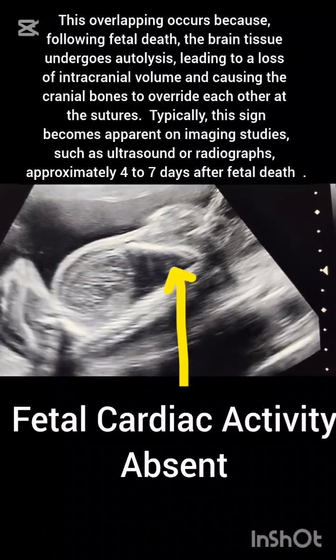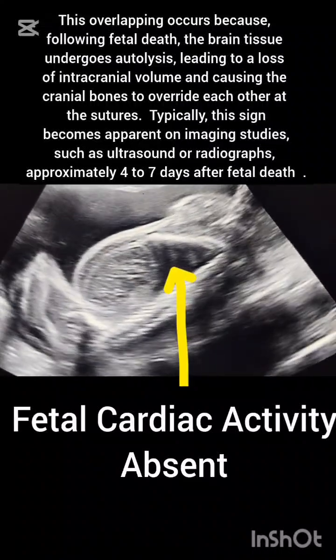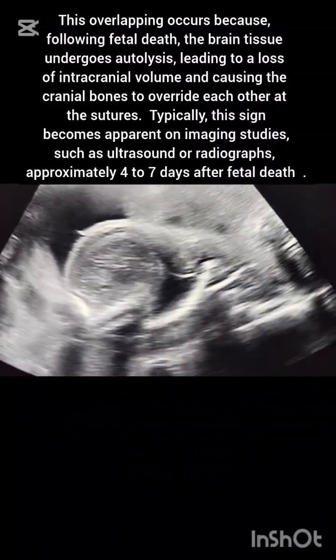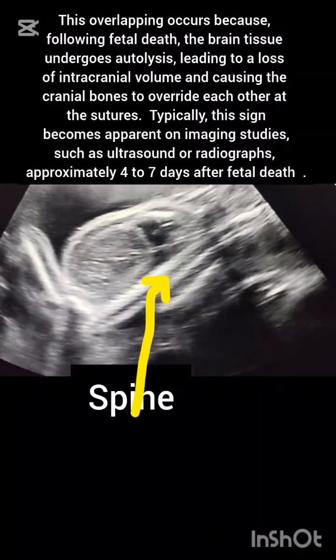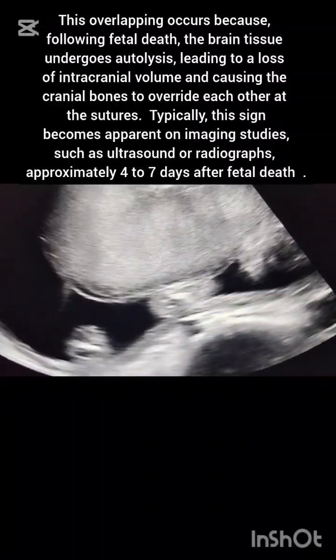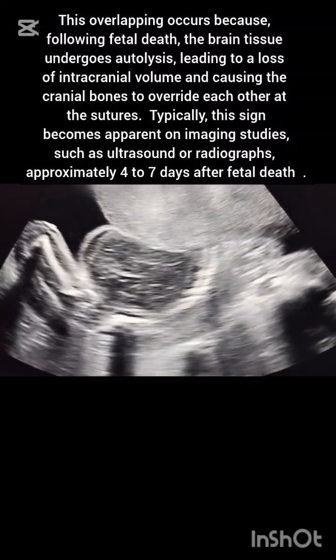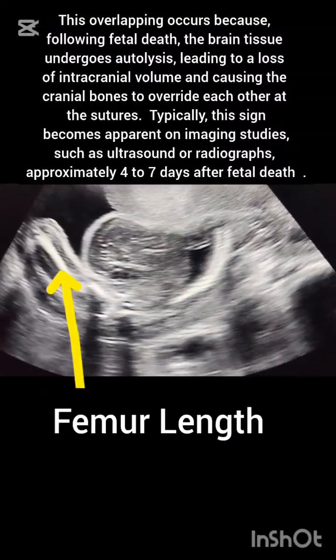Fetal cardiac activity is absent in this fetus. Autolysis leads to loss of intracranial volume, causing the cranial bones to override each other at the sutures. Typically this sign becomes apparent on imaging studies such as ultrasound or radiographs approximately four to seven days after fetal death.